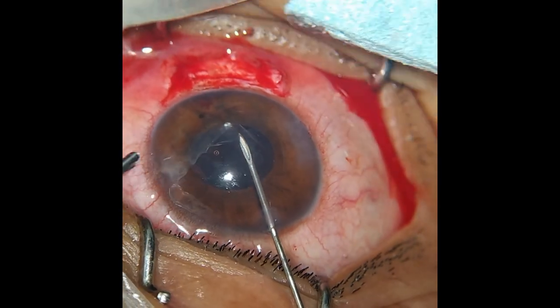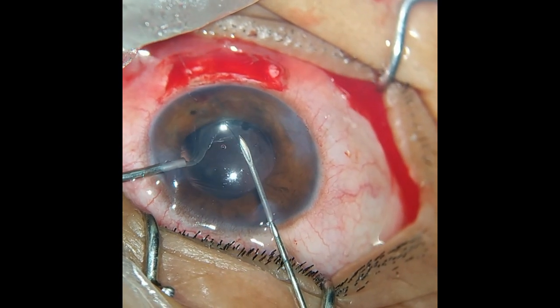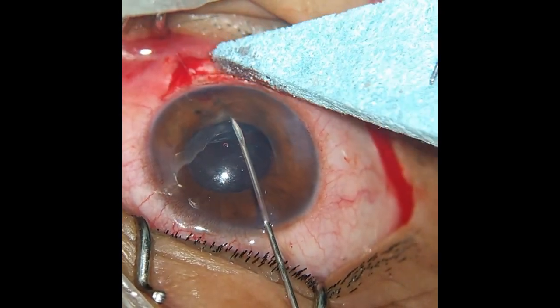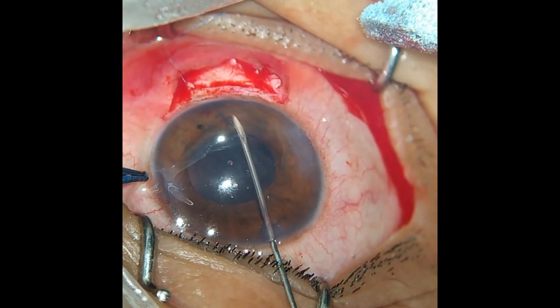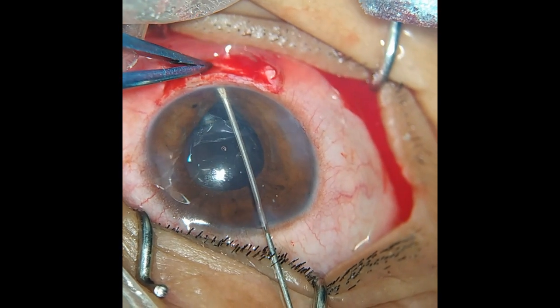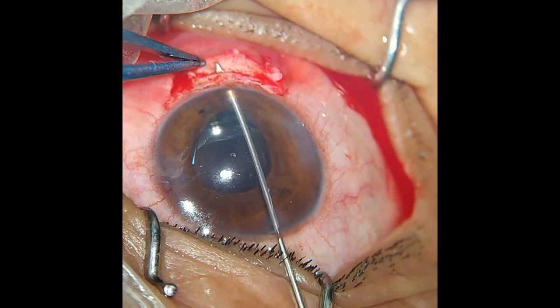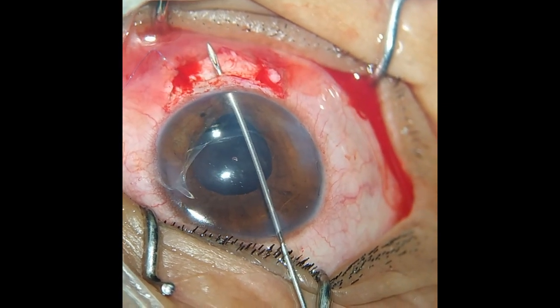The needle is used to take another bite of the iris root adjacent to the previous one, exiting in a similar manner. The iridodialysis repair can be done taking adjacent bites in this manner, with the needle acting similar to a needle in a sewing machine. This case has a limited dialysis, so 2 bites of the iris is enough to correct the dialysis.